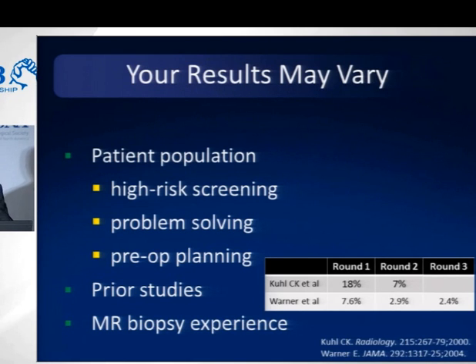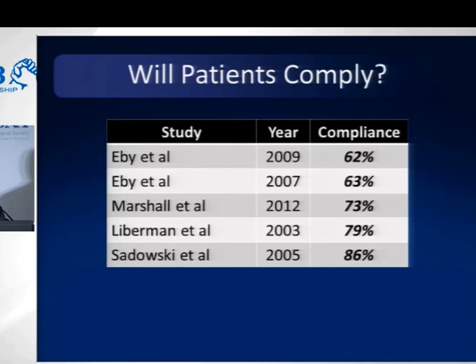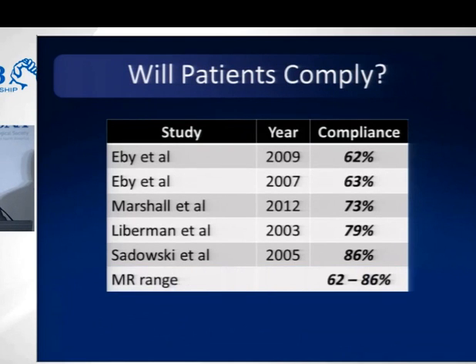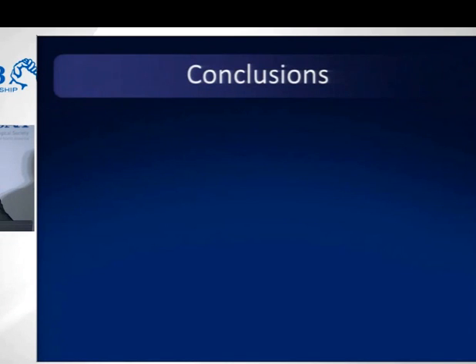It also depends on your MR biopsy experience. The more comfortable you are with MR biopsy, the less likely you're going to feel compelled to call something probably benign. You're more likely to feel comfortable just sticking a needle in it. Will patients comply? Will they come back for the MRI? The studies have shown that between 62 and 86% of patients will come back for the follow-up MRI, and that's almost identical to what we find with mammography. So as often as they come back for mammography, that's how often they'll come back for MRI.